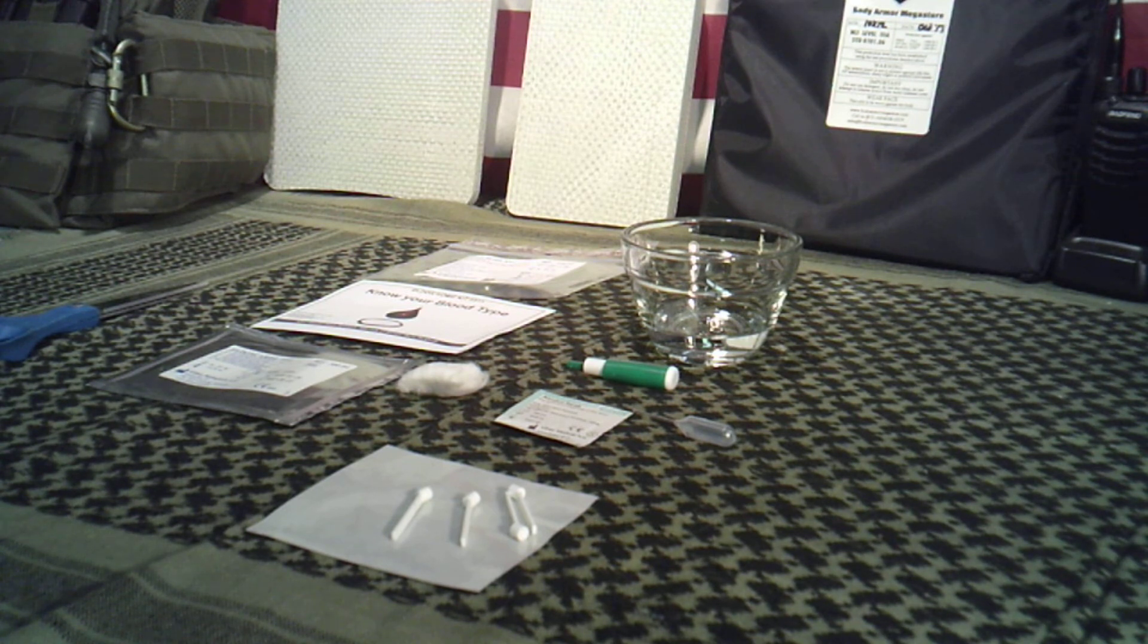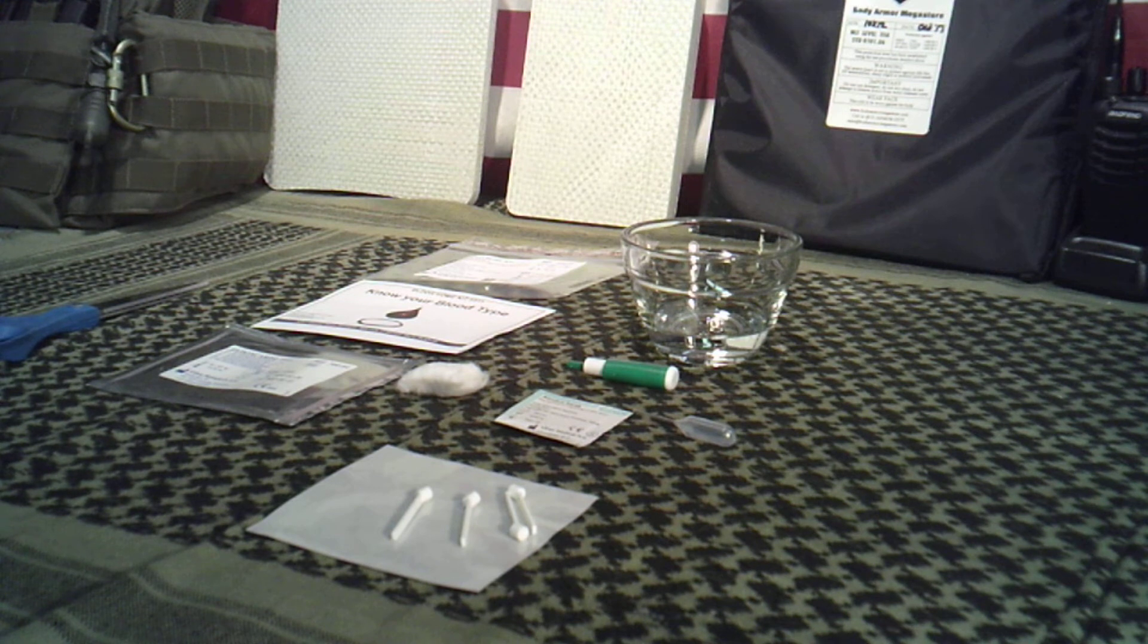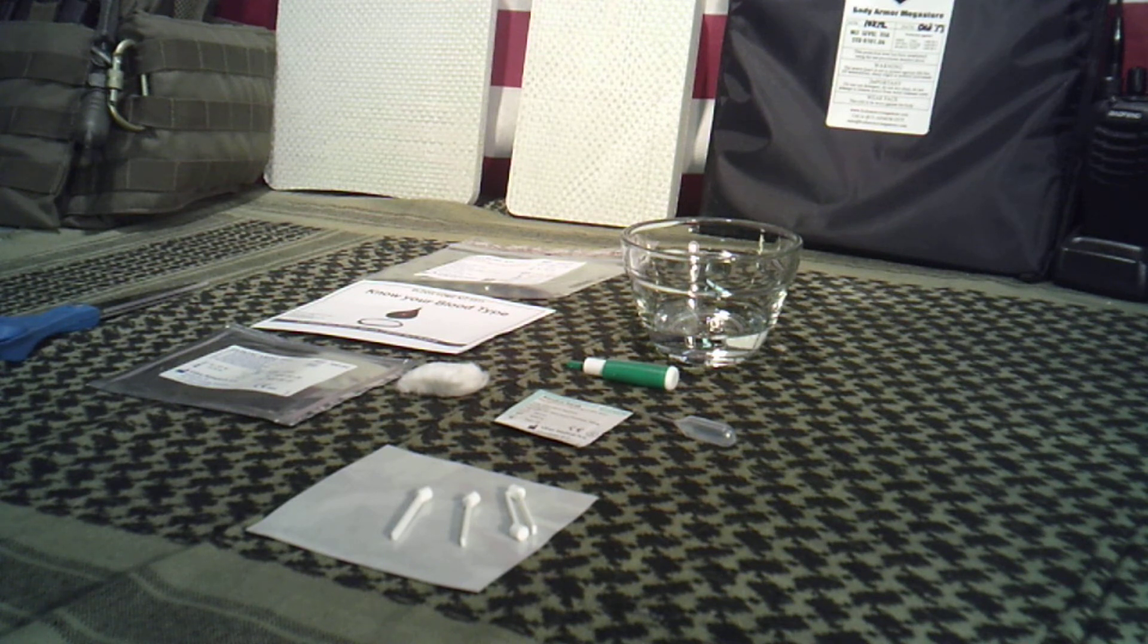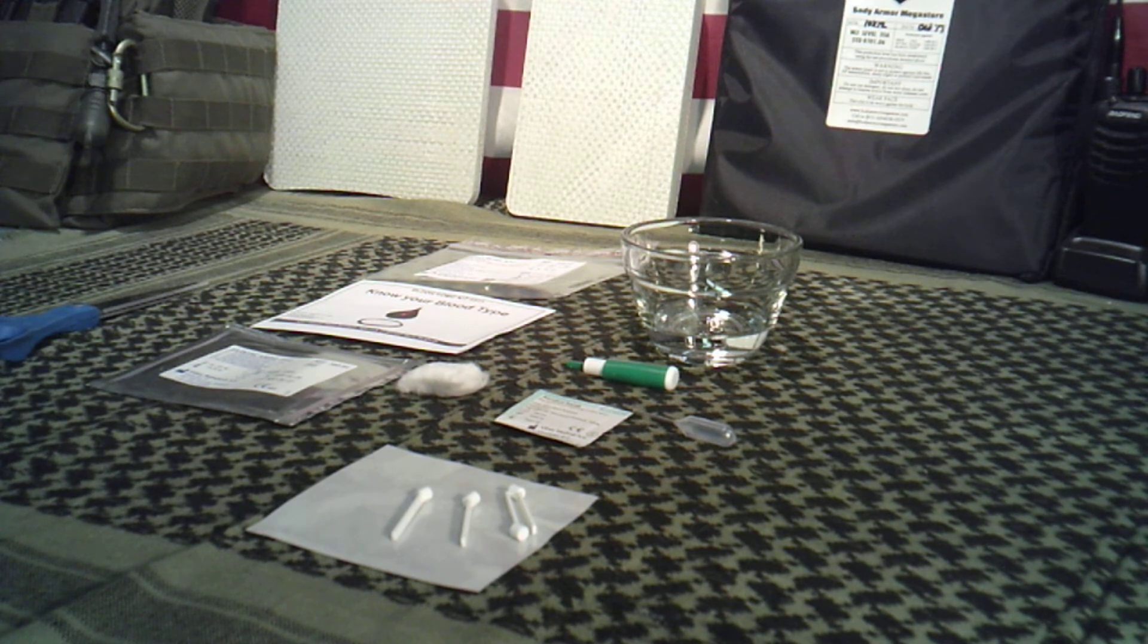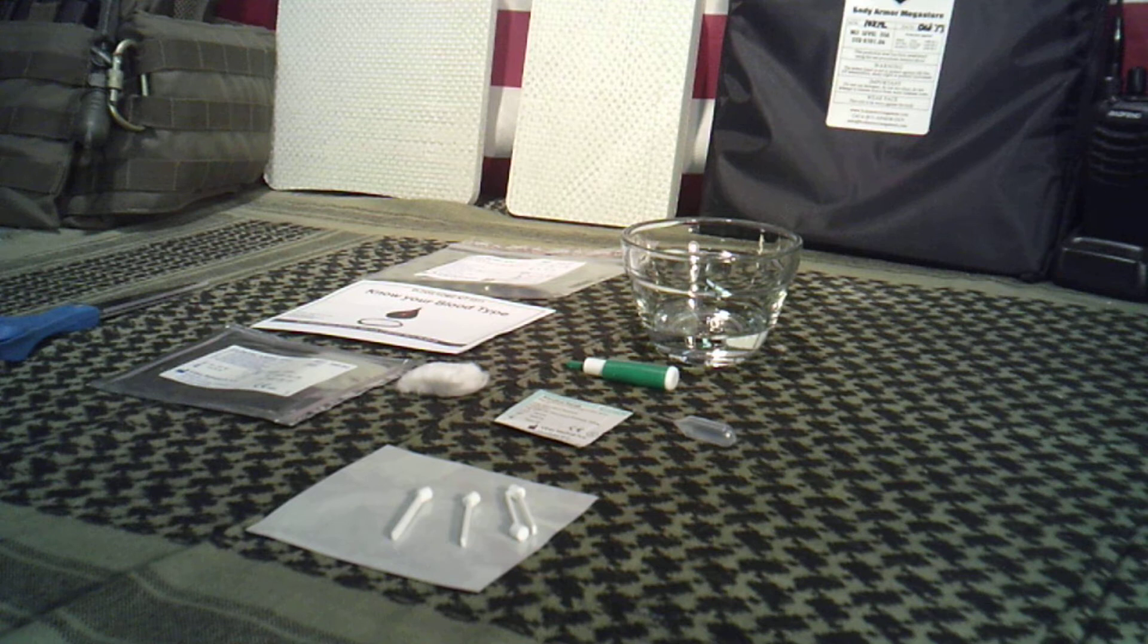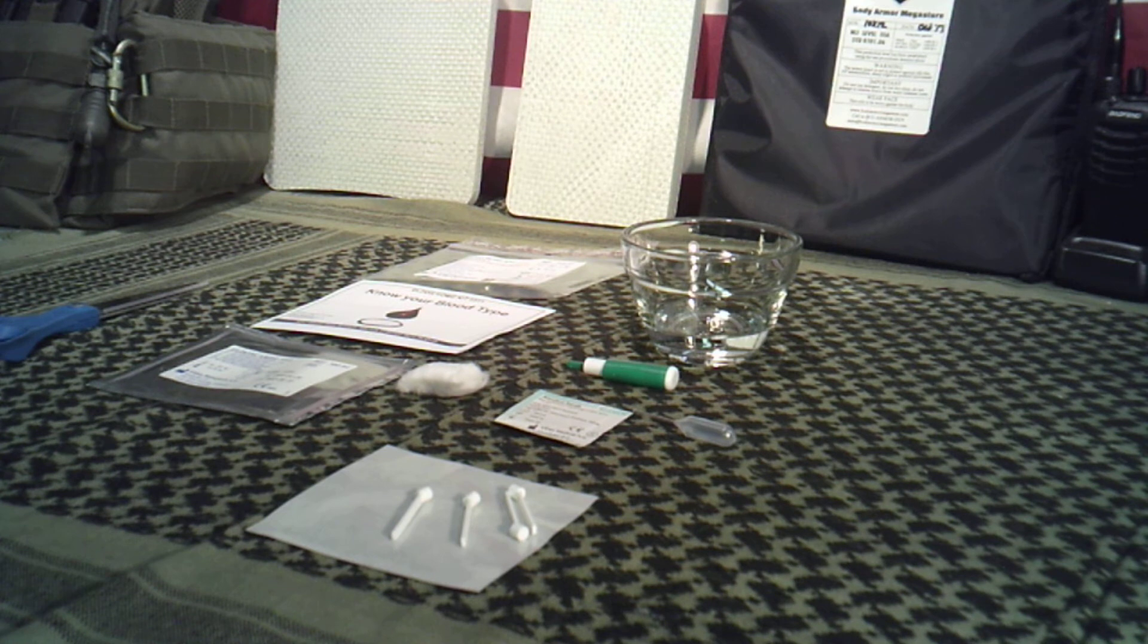These are the exact same kits that they get. They take about 10 or 15 minutes total, and you'll know your blood type pretty much after that and be able to have that information. I also think it's important that you know your family's blood type.